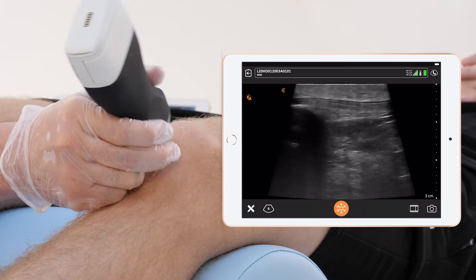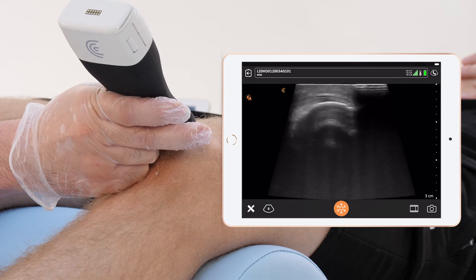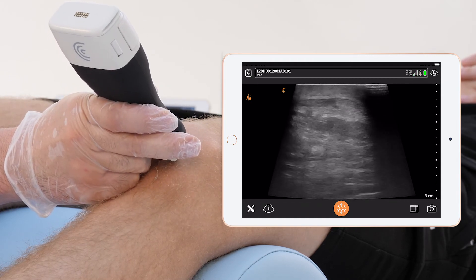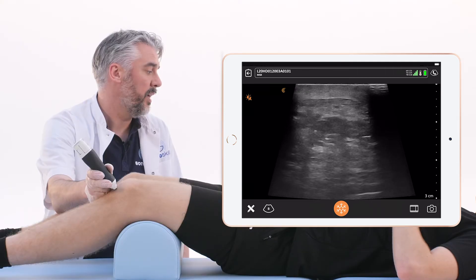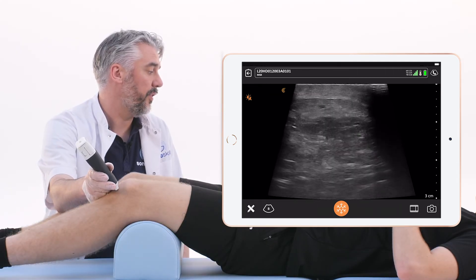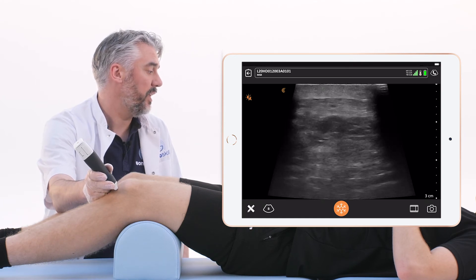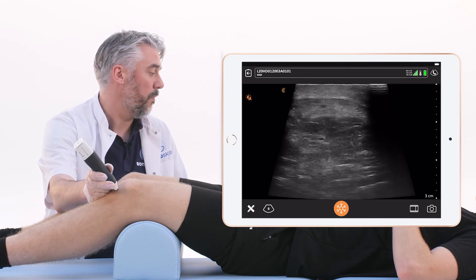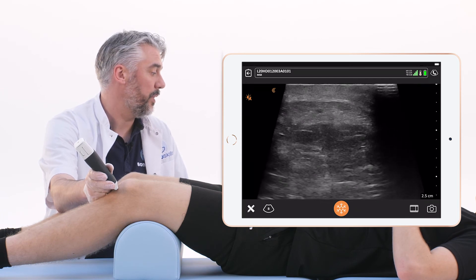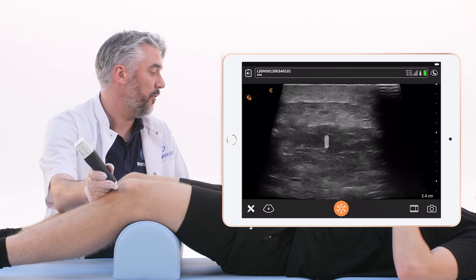The same assessment we can do in transverse view. We start on the patellar bone, and now we can see the width of the patellar tendon.